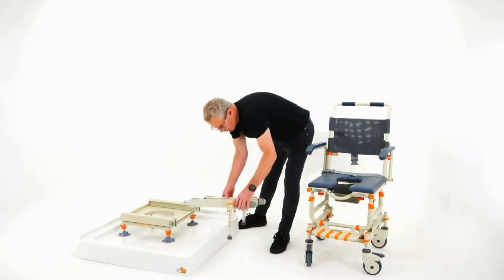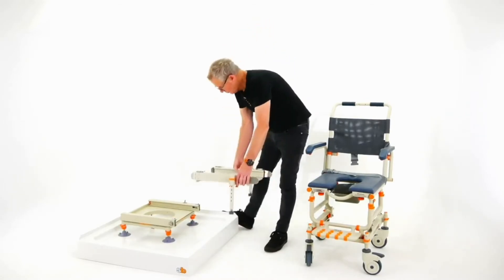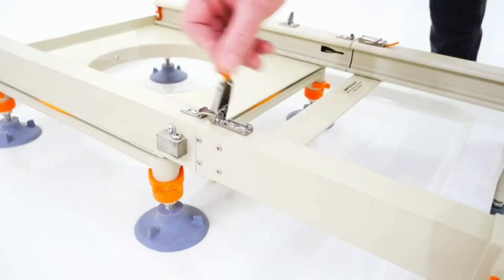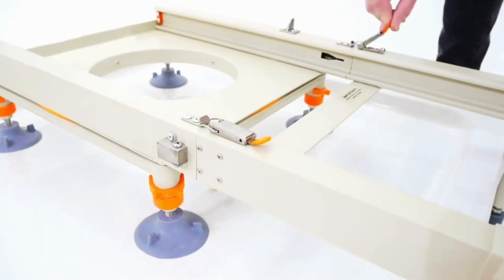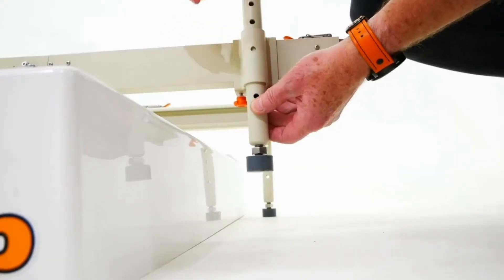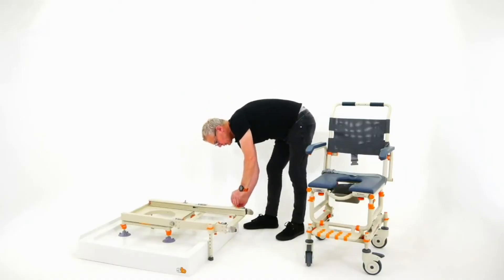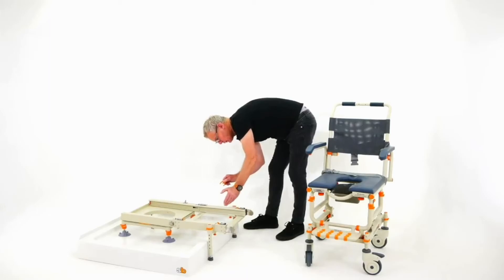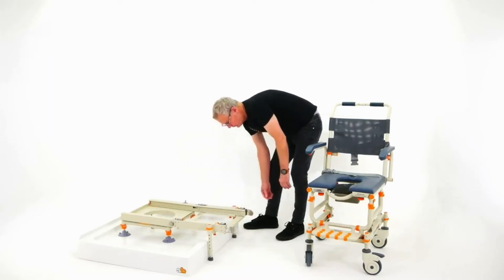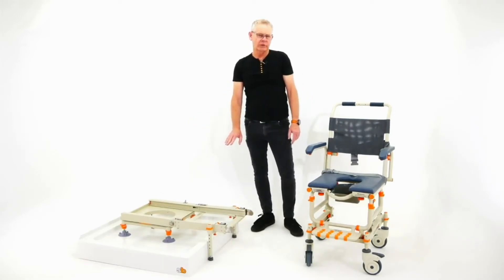Now the bridge — which is actually going to be your link to getting an accessible shower — pops in with little tongues into the shower base, and the latches just latch it together. I've set this portion up to the correct height already, but it's just a case of twisting the clip, taking it out, dropping it down to the right height, and getting the pin through. So that's got our base unit and our bridge set up.